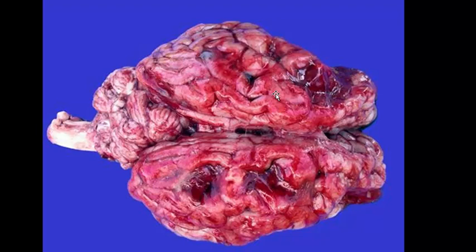So a great picture of bovine herpesvirus type 5, also from an old Wednesday slide conference. If you want to read more about this, consult the Wednesday slide conference, or you may look it up in volume 1 of Jubb and Kennedy, pages 381 to 382. Well, that brings me to the end of this.